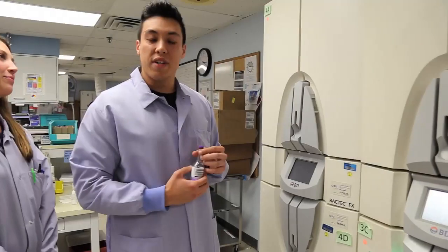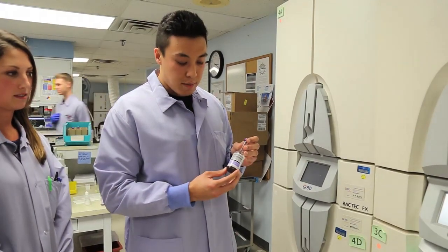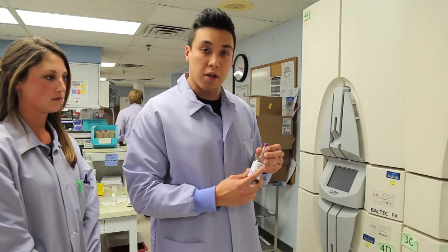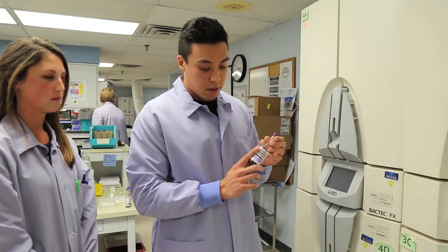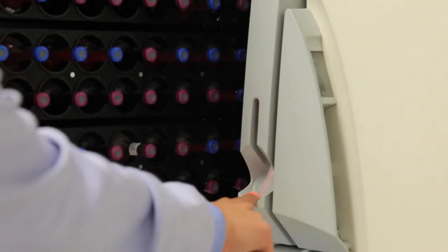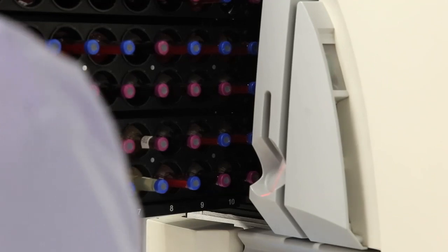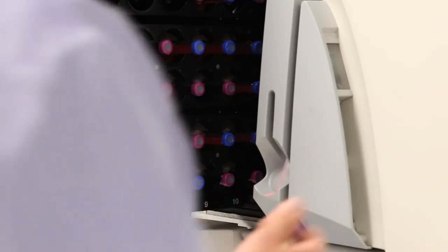So revisiting a common thing that we see in the lab that we had mentioned earlier is that we do get patient barcodes that cover up the bottle barcodes. Both barcodes are used when putting them on the instrument, so it really does help if this barcode on the bottle is still exposed. For example, they have a groove here with a laser that detects the barcode and will put all the information on the instrument. So we do need this exposed to be able to load the bottle, and it can determine what type it is, how long it should be incubated, and so on and so forth.